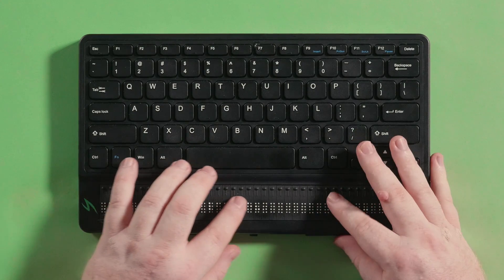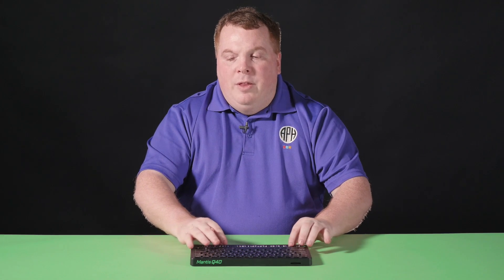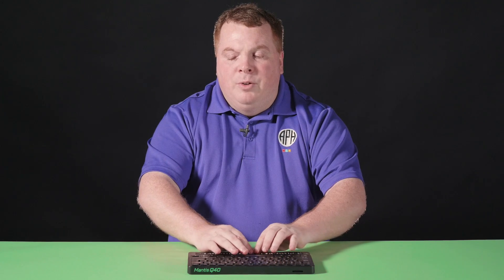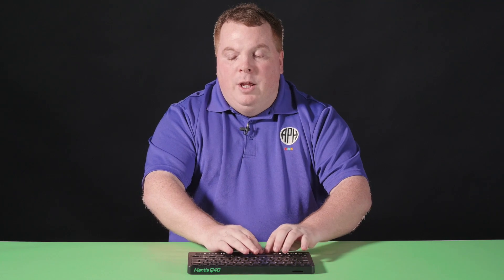What is Terminal Mode? Terminal Mode is how you pair with other devices such as a computer or smartphone by using either Bluetooth or USB-C. While paired, the screen reader controls the majority of your functionality. This includes what Braille is being displayed and what hotkeys you will use.